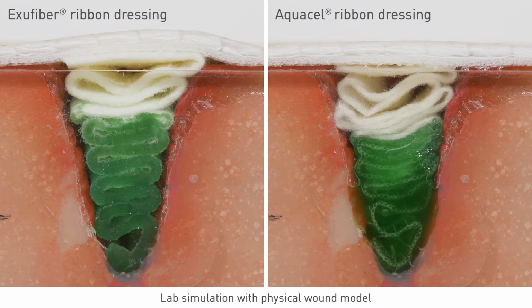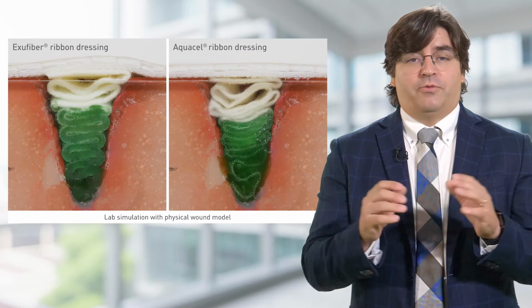You see there's a lot of collection of fluid on the bottom, and on the left, you see that they have, again, empty spaces without any kind of fluid. So you can see immediately there's a huge difference between both of them. Large space and fulfill of fluid.